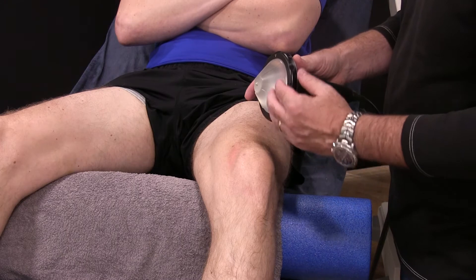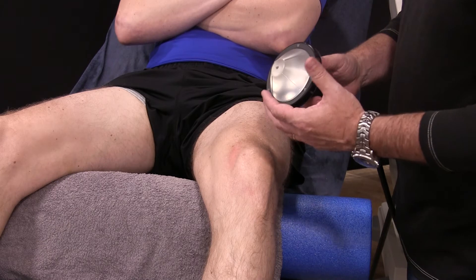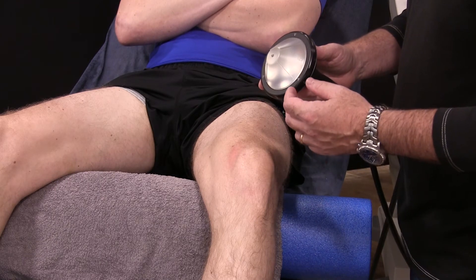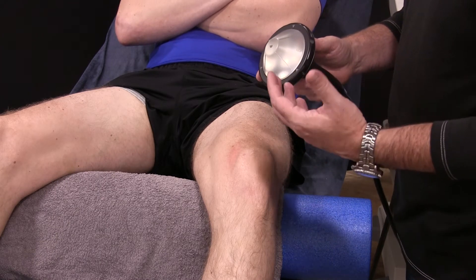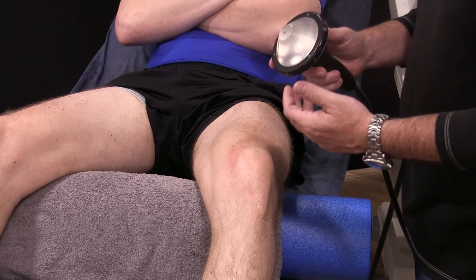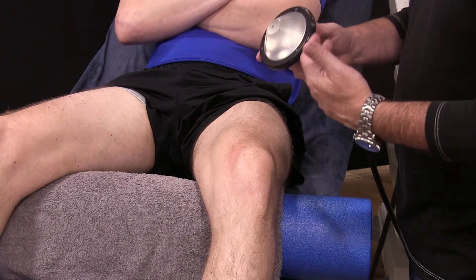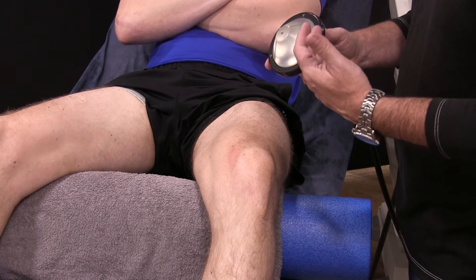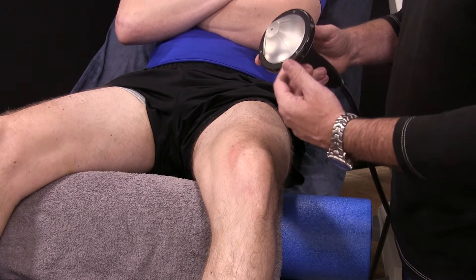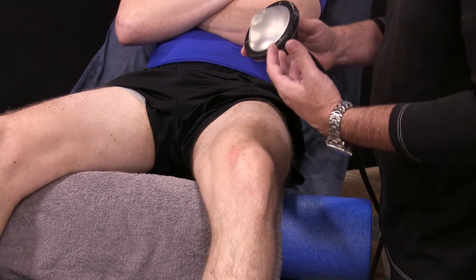Depending on the depth of the tissue, we would select a different gel to focus that pressure wave. The nice thing about the focused shock wave is that we can modify the intensity of that acoustic pressure so that we can work within the pain tolerances of the patient and ensure we don't override those thresholds, so as not to damage tissue or injure them further.